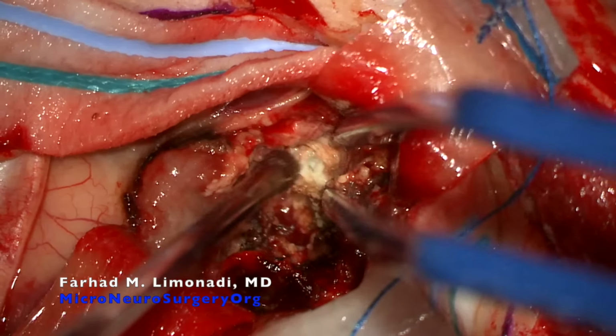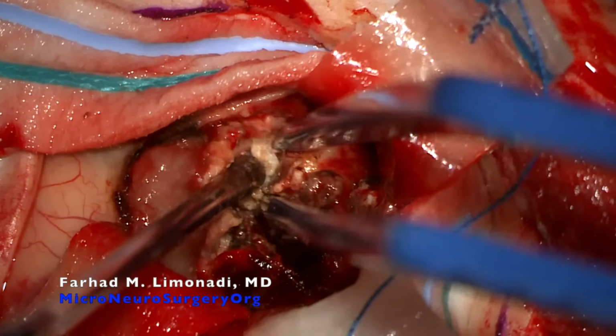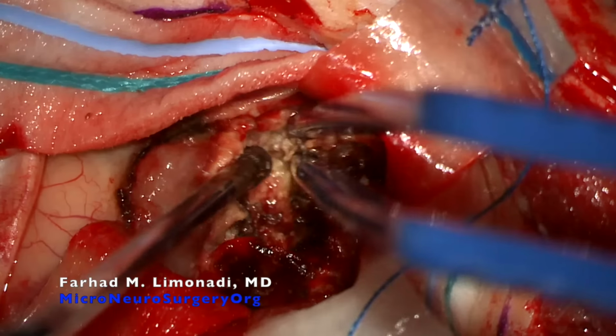Tumor is further debulked to reduce its volume and in order to be able to deliver it out of this relatively small corridor.